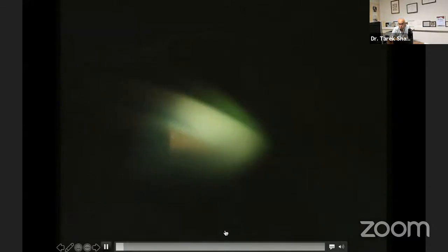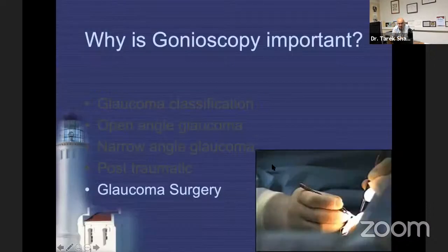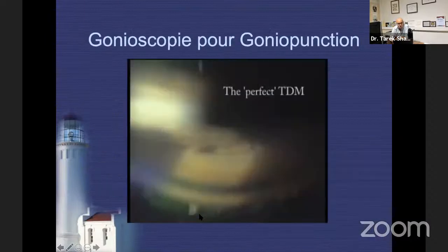A video shows pyramidal synechiae associated with uveitis — secondary closed-angle glaucoma. Here is a synechial closure that is easy to identify, associated with angle recession. I love this case because it reminds me: don't just accept the obvious. Sometimes there is something else hiding behind the evident finding.